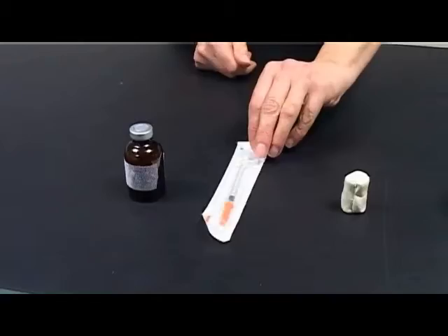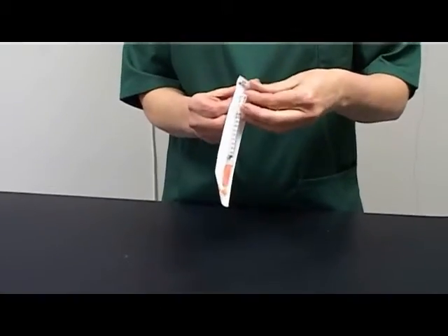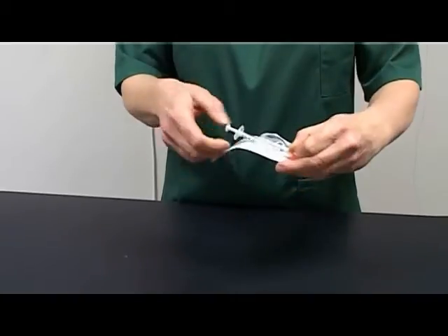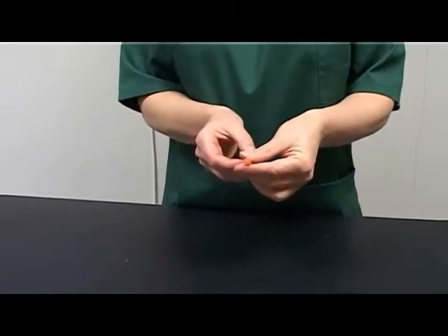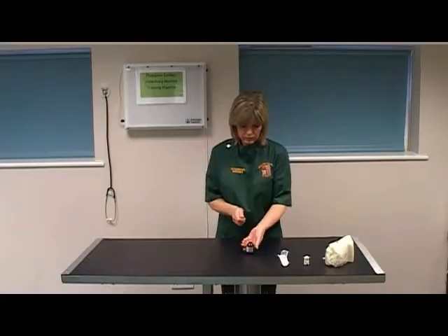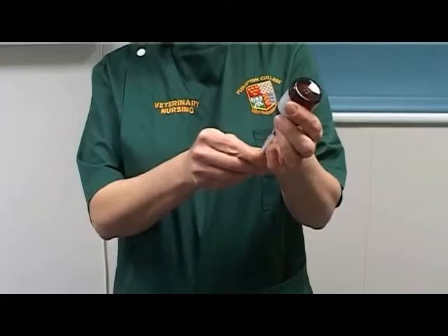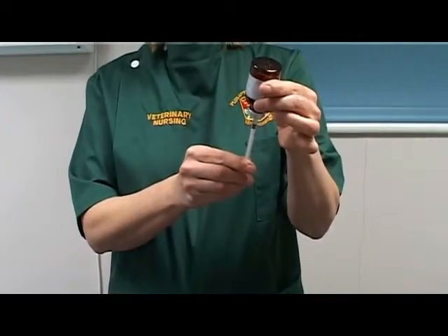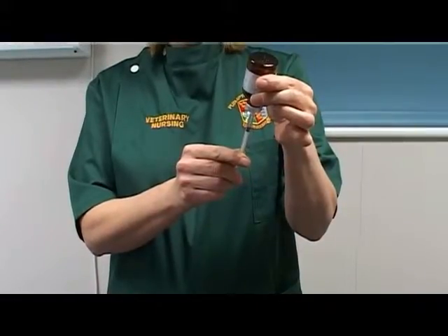Select an insulin syringe and needle. Introduce the needle to the vial aseptically. Draw back the correct volume of drug required — in this example, five international units.